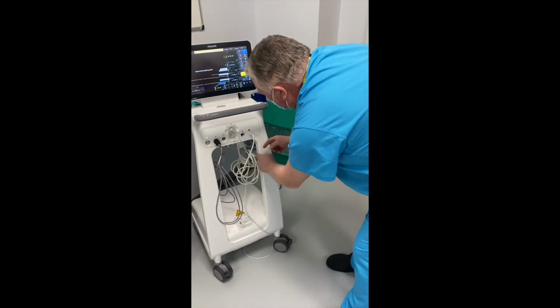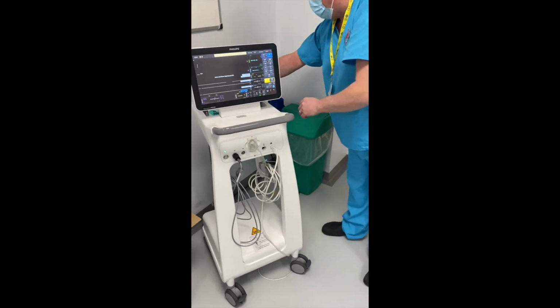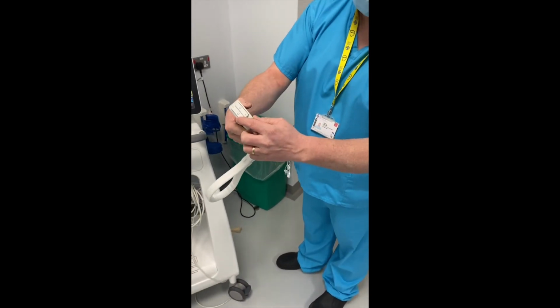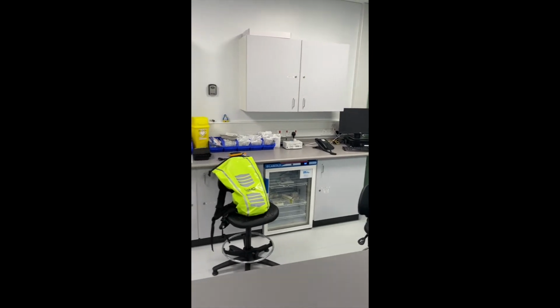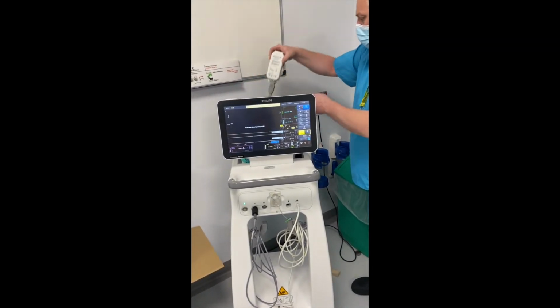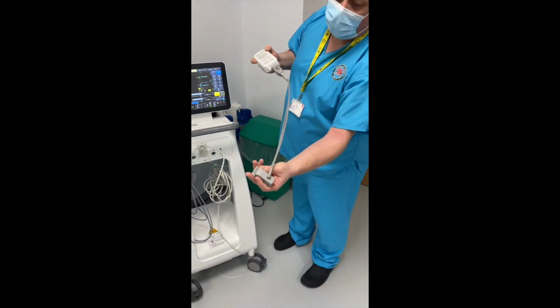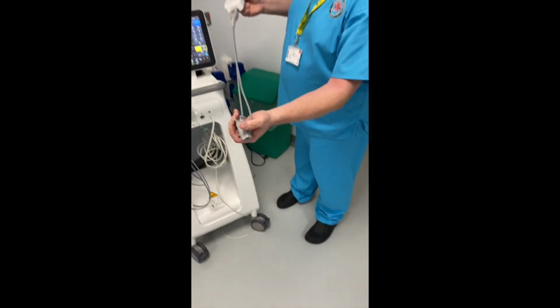You've got CO2, you've got non-invasive blood pressure, which we don't tend to use very much. And then at the back here are the wireless ECG, which are battery operated. So you need to make sure the batteries are fully charged. The charging point is over there. And the radiographers normally change them in between cases, so make sure they're fully charged. So that's your ECG, and then you also have pulse ox. And then there's 2 different adult clips, and then there's one label P, which is for pediatric. Generally you need the adult clip for ICU patients.